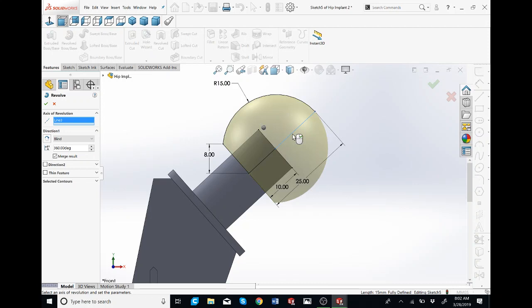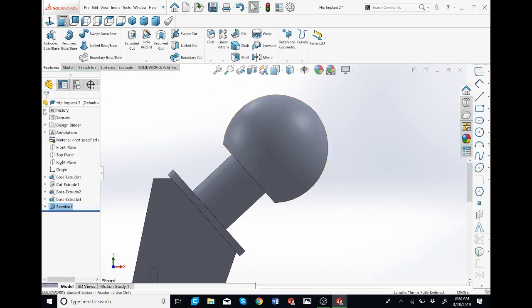You also see when I click on the line, SolidWorks has this thing where on my mouse you see a mouse and it shows a right click that has a check mark. If you just right click it, it will do it for you, or give us a check mark if you lose it.